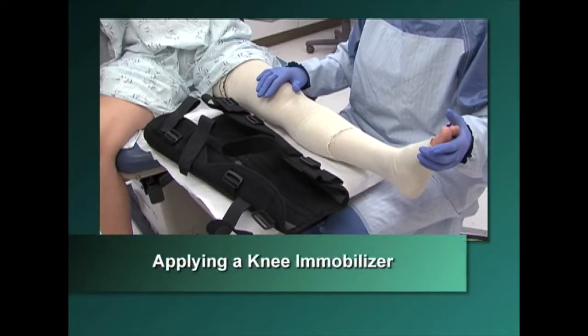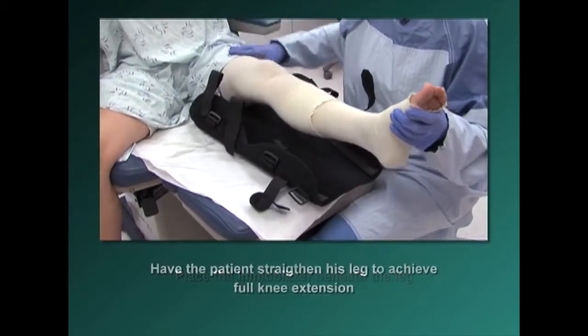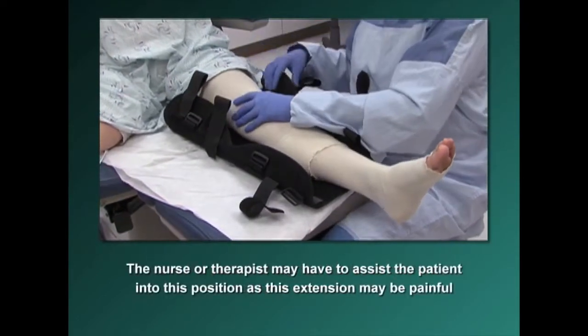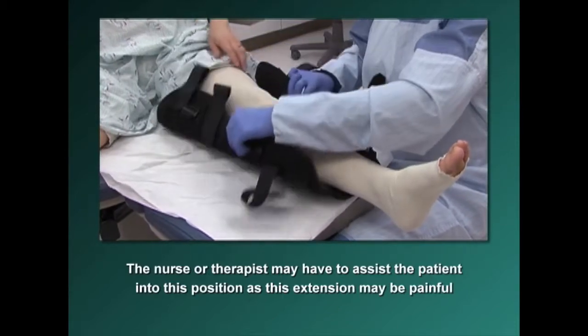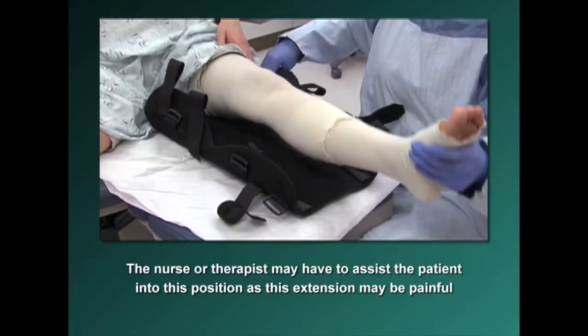To apply a knee immobilizer, place the immobilizer beneath the patient's leg and have the patient straighten the leg to achieve full knee extension. The nurse or therapist may have to assist the patient into this position, as this extension may be painful secondary to the burn injury or joint stiffness from immobility.